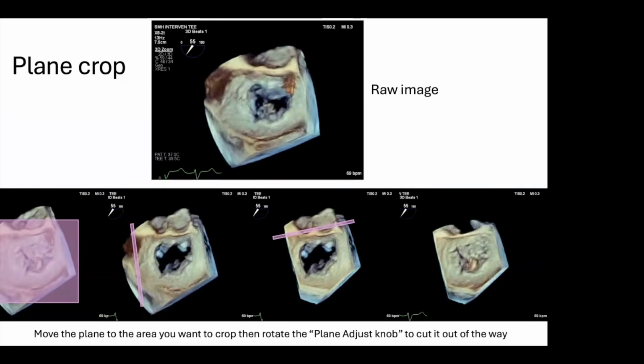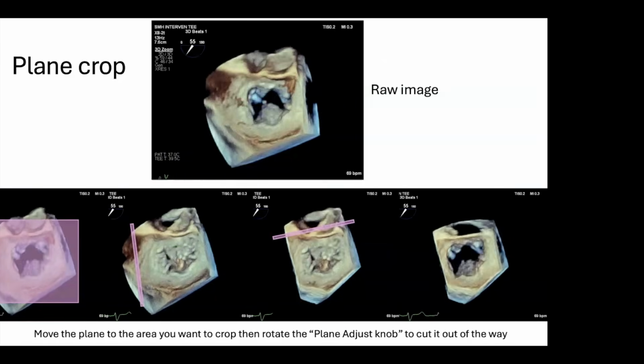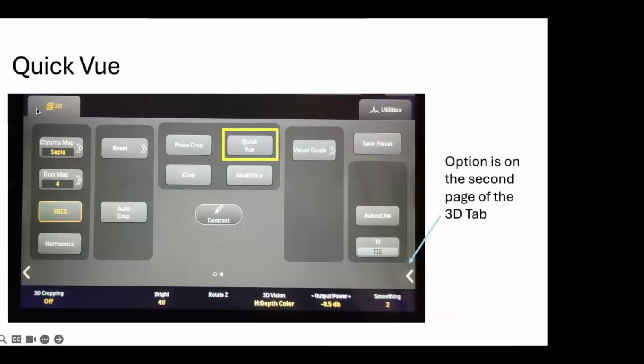And important to note that just by cropping it, you don't actually improve the frame rate, but it improves how the image looks and is presented. And so plane crop gives you a lot of control to do that.